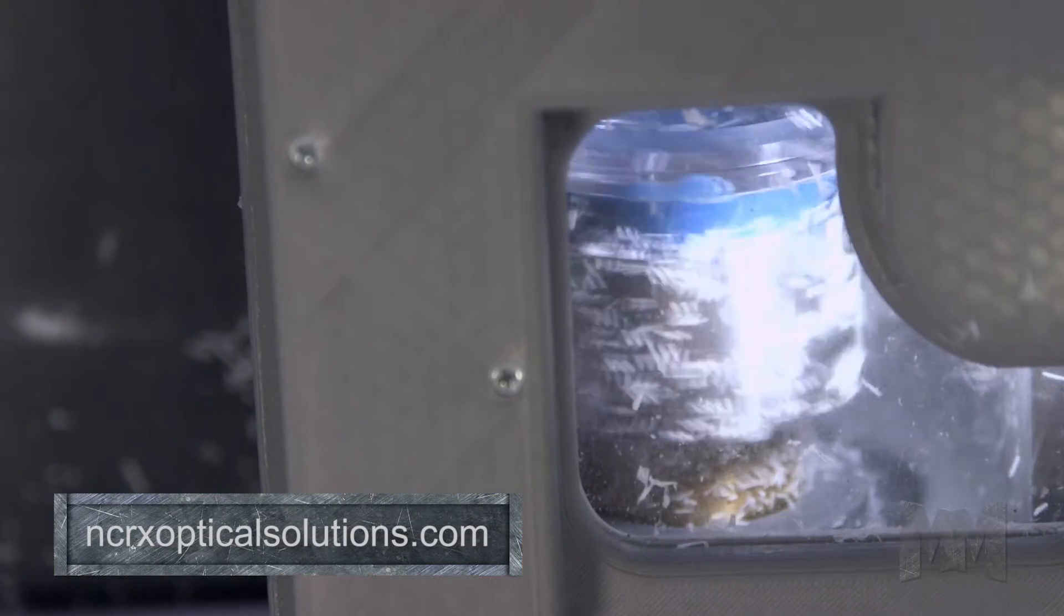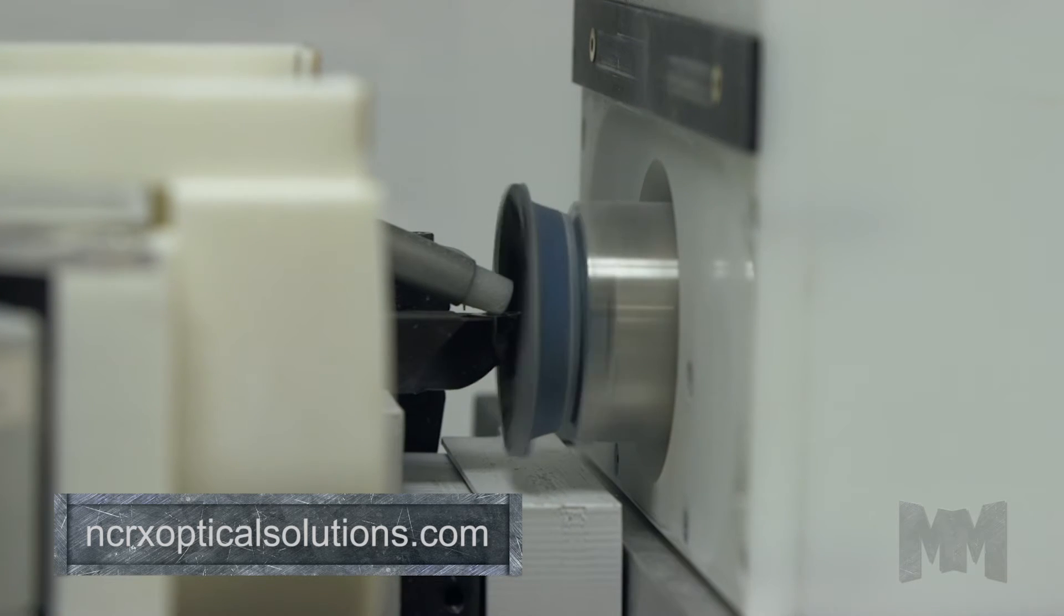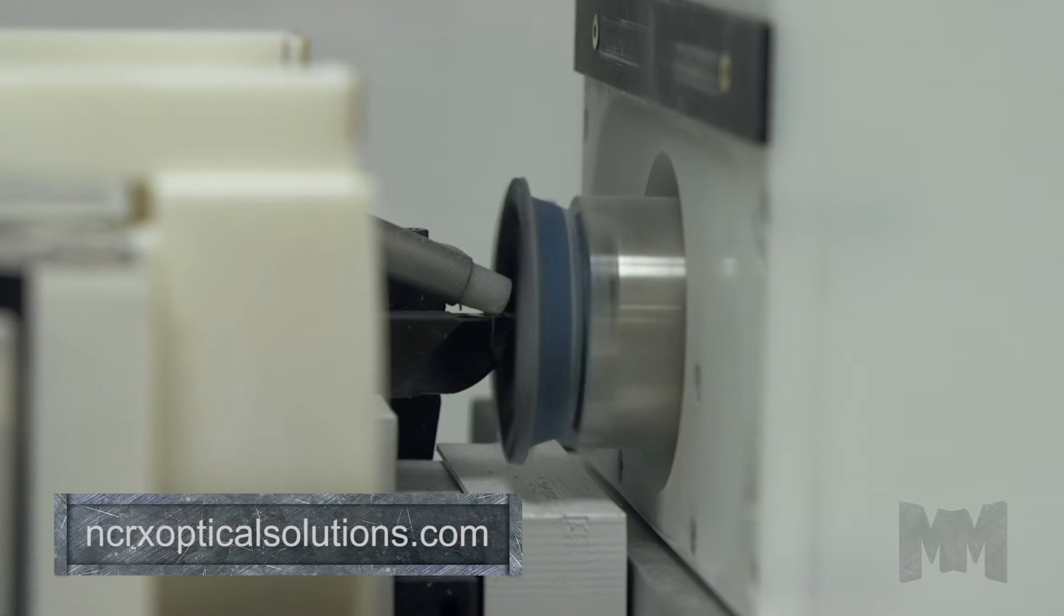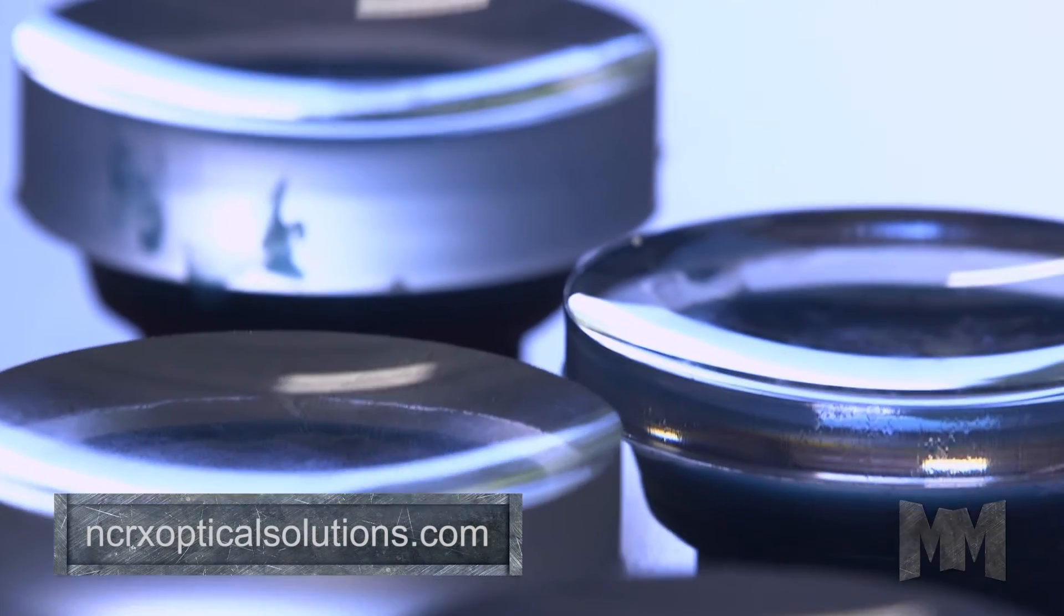Using conventional wax blocking, the NCRX Lab system can produce up to 10 pair of digital progressive lenses per hour. Using alloy blocking, the system can produce even more.